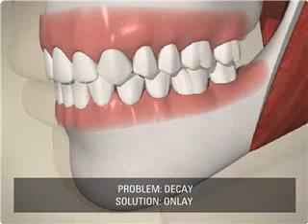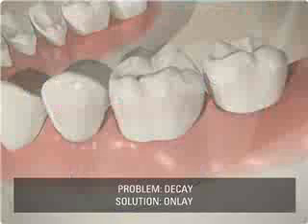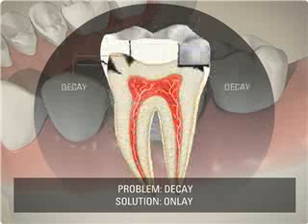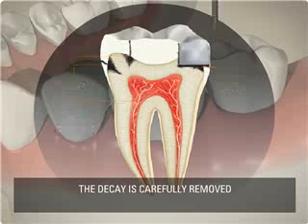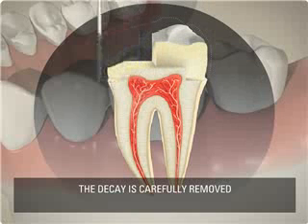For a tooth with slight decay that affects at least one cusp, an onlay restoration can be used. In this example, the decay is through the tooth's enamel, damaging a cusp, but has not progressed all the way to the pulp chamber. The decay and any affected cusps are removed to prepare for the onlay.